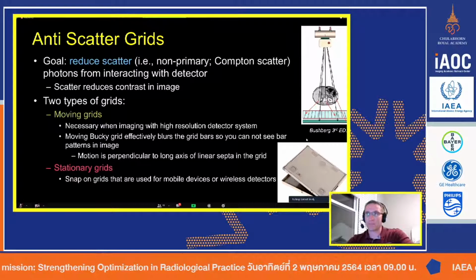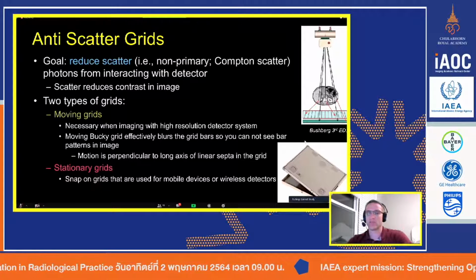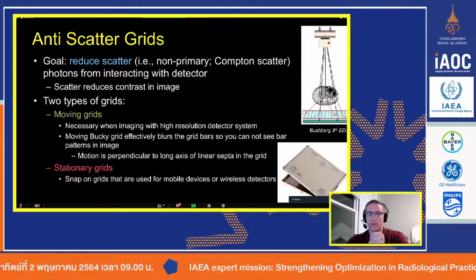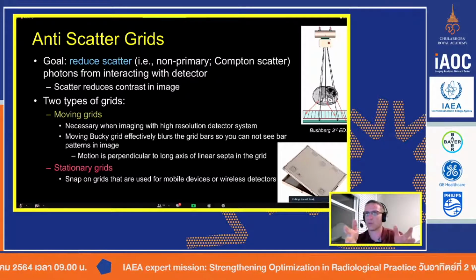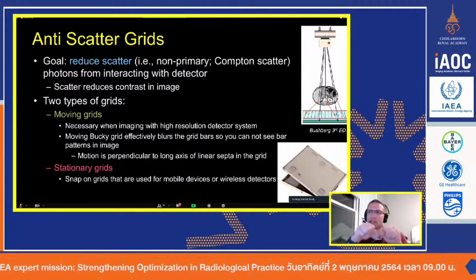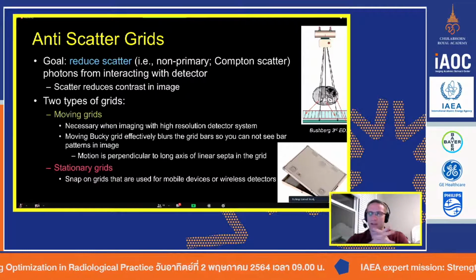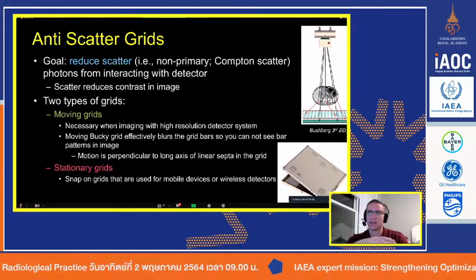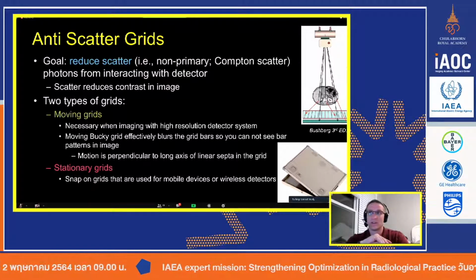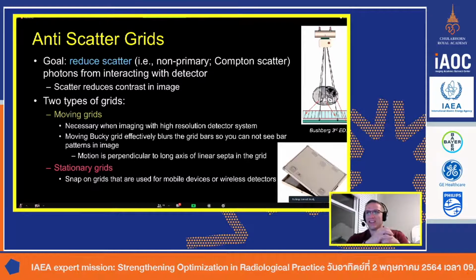The other option is there are actually very lightweight grids out there. For example, when I was there and I went around with Dr. Panutai, she showed me some of the GE portables you had at one of your hospitals. I know you don't all have GE portables, but GE has very lightweight carbon fiber. The first thing I did when I worked at my last place, we used all of these really heavy lead anti-scatter grids, and the technologists never used them because they were just really heavy. And you drop one of those on your toes and that's the end of your day.